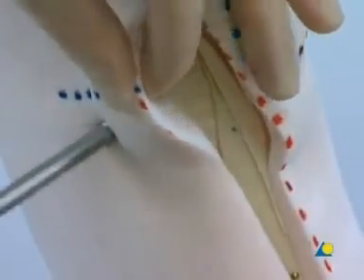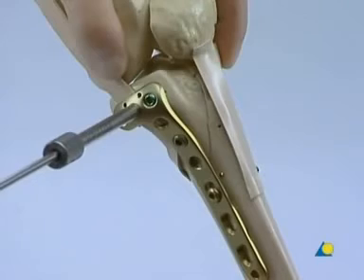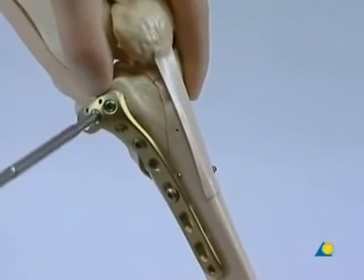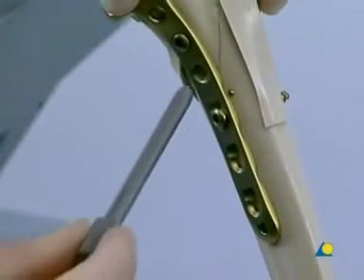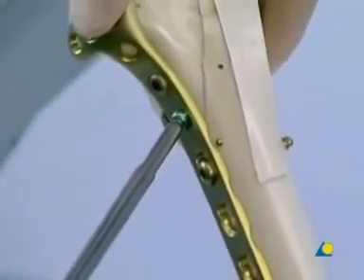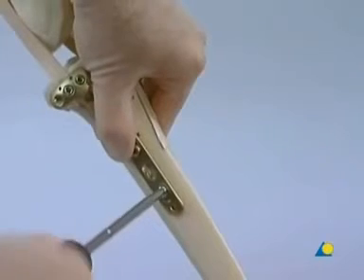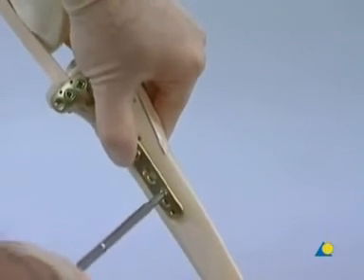A second locking head screw is inserted through the middle plate hole of the proximal end of the plate, in a similar manner to the first one. The proximal fixation is completed by using a locking head screw just proximal to the apex of the fracture. Finally, another locking head screw is inserted through the most distal plate hole.